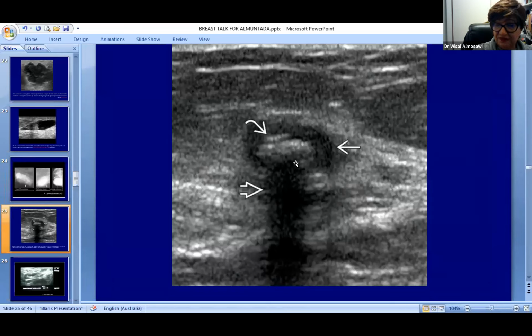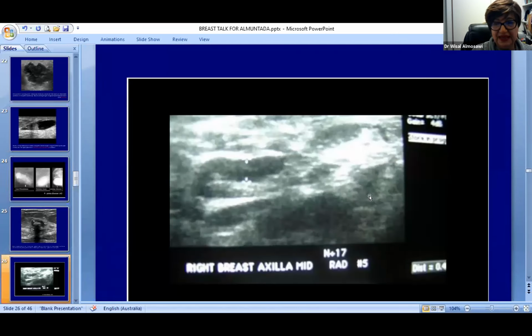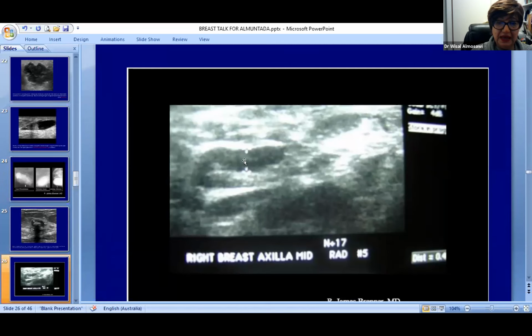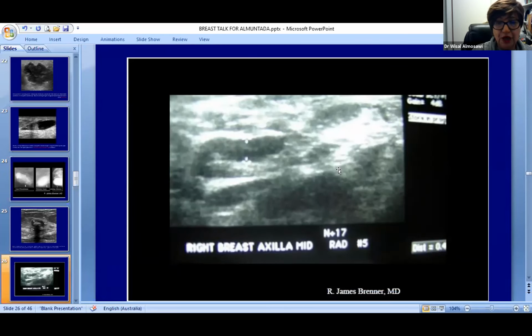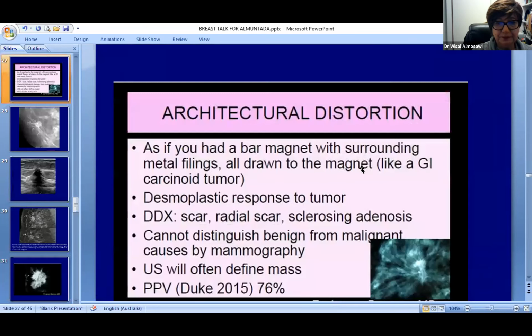Sometimes you can find calcification with ultrasound, and that will make it easy to do the localization and to do the biopsy instead of the stereotactic, but it's not always the case. Every time we do a breast ultrasound, we have to look at the axillary lymph nodes, because we look at the cortex. If the cortex of a lymph node is more than 2 millimeters, we ought to biopsy this lymph node because this could be infiltrative.